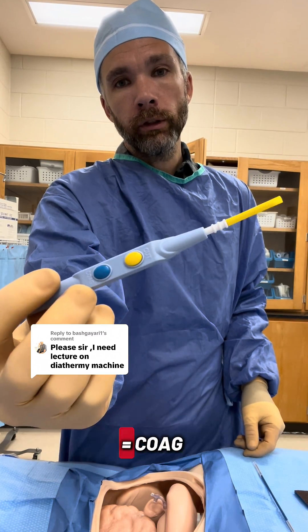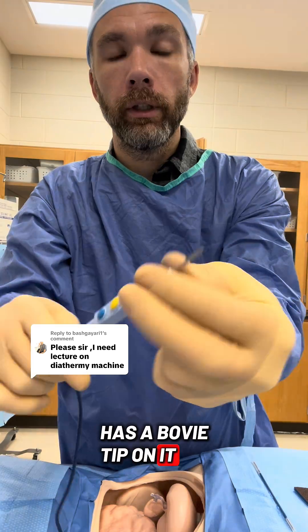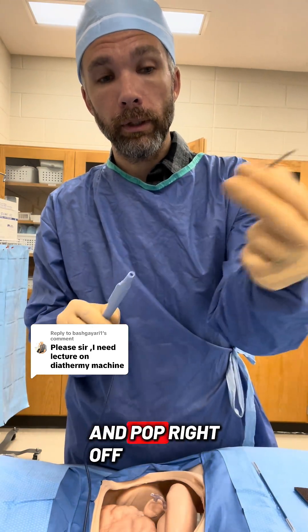This is a Bovie. Blue button is coag, yellow button is cut. It may come with a cover on it and has a Bovie tip on it. The Bovie tip comes off. If you're doing big open counts, you're going to want to count these Bovie tips. They just pop back in there and pop off.